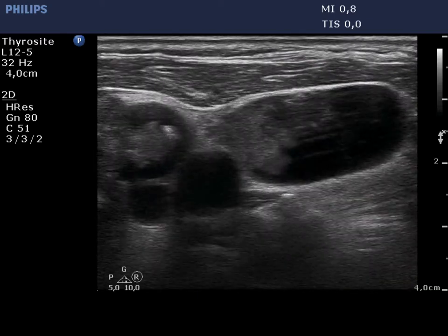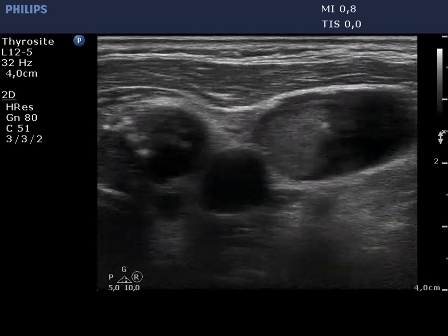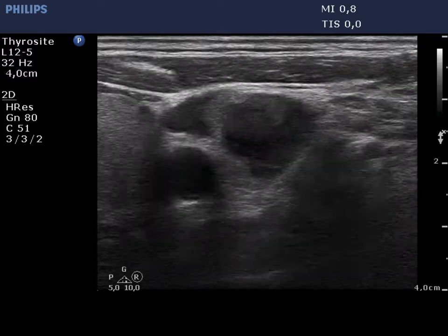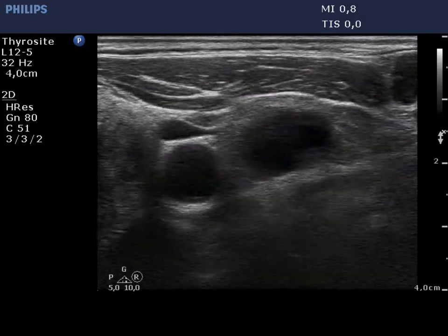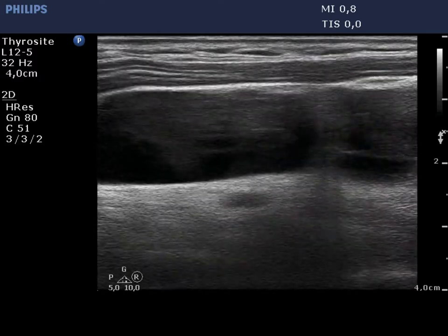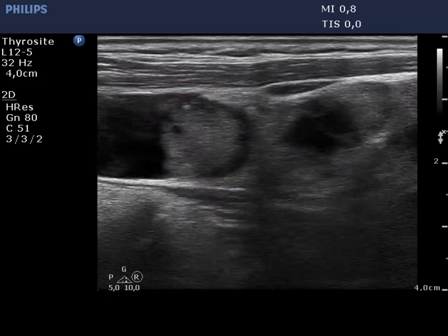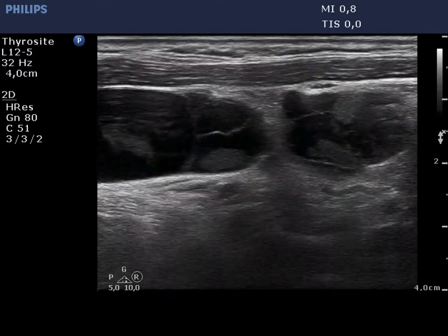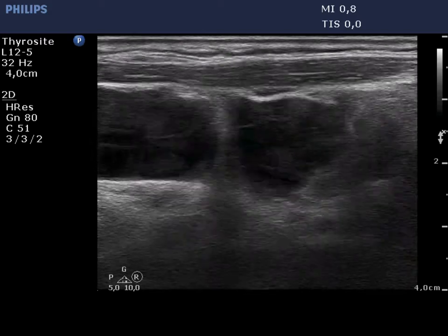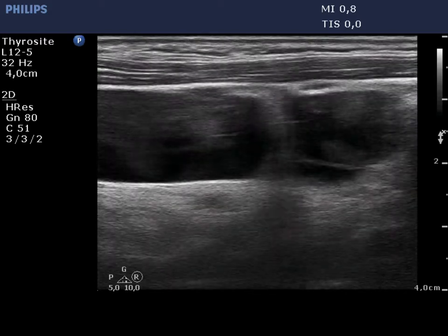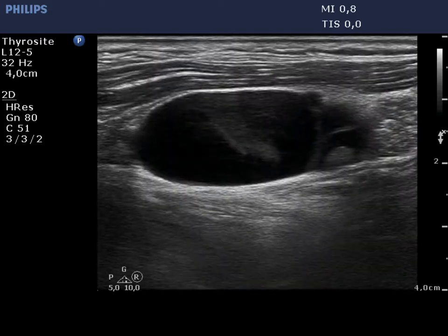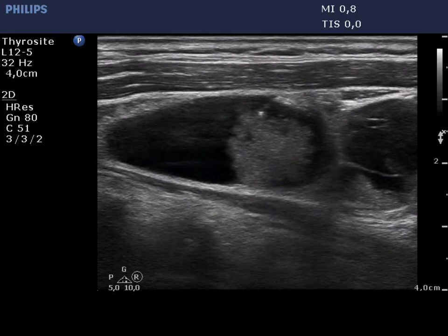There are multiple lymph nodes lateral to the left lobe with an echo pattern similar to that of the thyroid nodule. The nodes display cystic degeneration and hyperechoic granules. Cystic degeneration of a neck lymph node alone raises suspicion of metastasis.